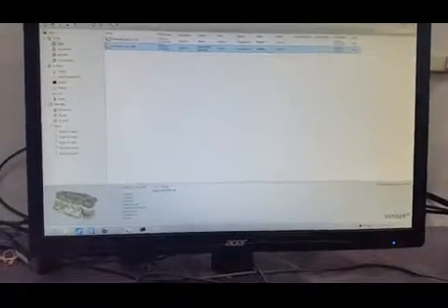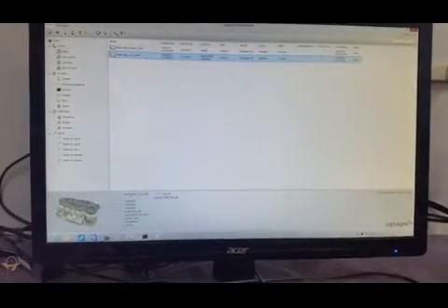And we finished, we close, and we hit F7, and that just created an STL file. If we go to the milling machine right now, we'll find that there, and we'll go ahead and mill it.